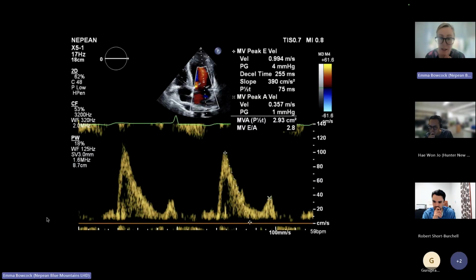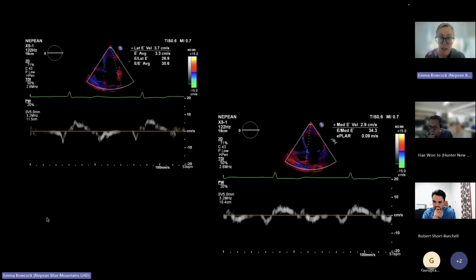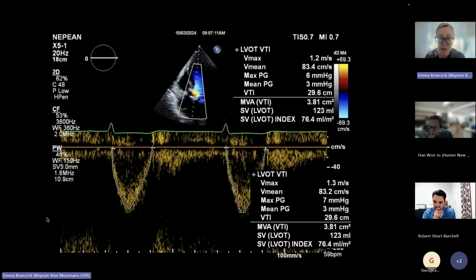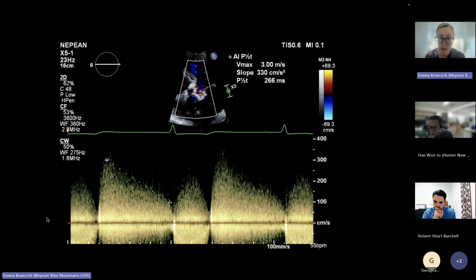But coming back to the valve, which is where I think obviously there's concern about the valve as well. You're absolutely right. You need to look at all of the previous things. But let's have a look at some of the values. So let's just come to this one.